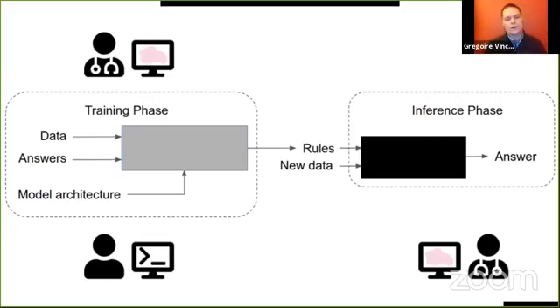and even show them all the different intermediate results during the training, to be sure that at the end the trained model will fit exactly what the pathologist needed. And mainly because it's not only one algorithm, generally it's a collection of algorithms which calculate different metrics needed for a diagnostic, which is very wide and more global afterwards.